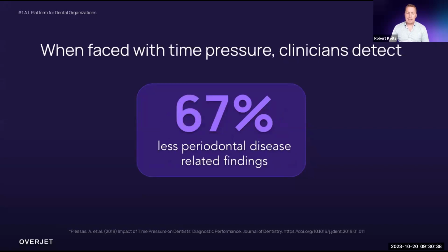And then if you look at that study, the impact on periodontal related findings, so your bone loss, your calculus, 67% less findings related to periodontal disease when under time pressure. Now that could be for a couple of reasons. In my mind, it's probably because we're restorative dentists. And so if we have a limited amount of time, we're going to look for the restorative features first. So that's probably a big challenge there.